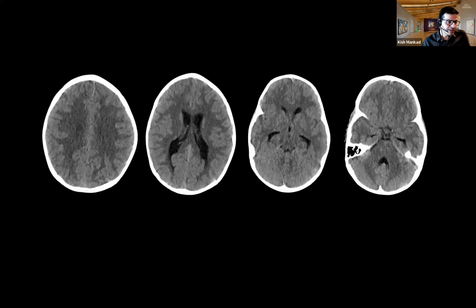When you put the question as safe to lumbar puncture, a fast CT scan is done, which could be 5 to 10 millimeter slice thickness, because only a very specific question is being addressed. If your question was whether there is any evidence of meningoencephalitis, then the radiologist would be tempted to do a contrast CT scan.